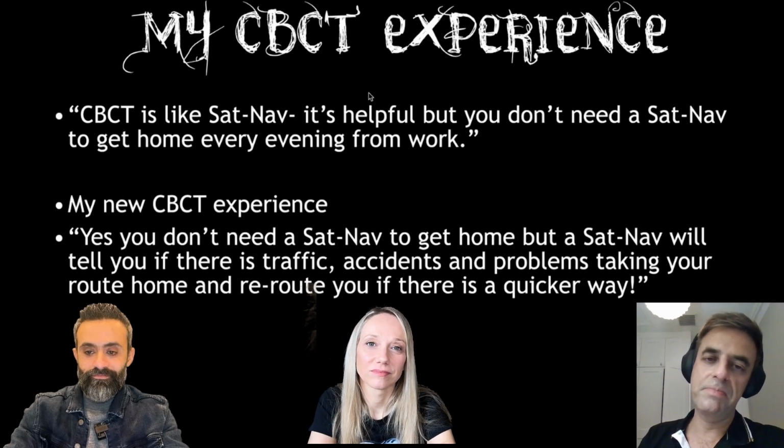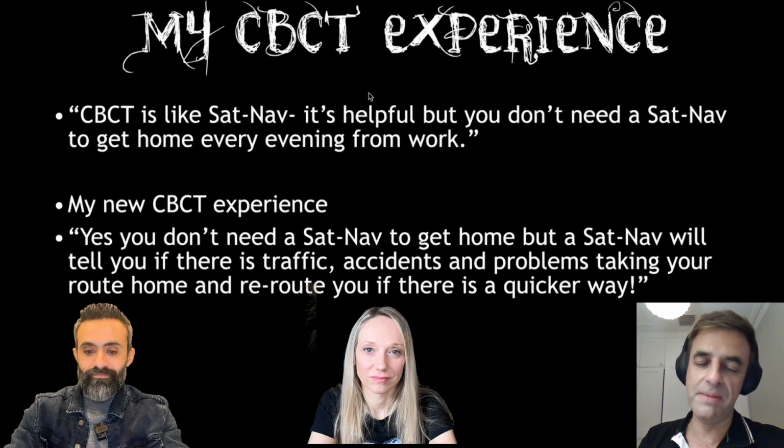It means that you can treat patients more efficiently. Obviously, the patients prefer that. They don't want to sit in the chair for hours. They don't want to come back multiple times for you to look for something that's not there. You can save dentine by not having to trough away looking for something that isn't there. And I find that very, very useful.